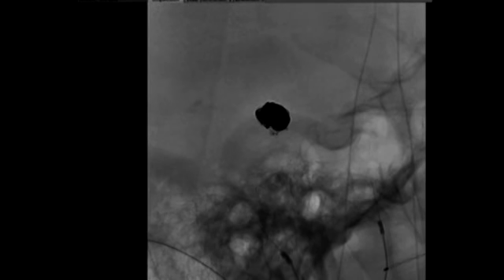In order to do that, we replaced the catheter that was used before, the balloon catheter, over an exchange wire. We used an Accelerator wire inside the balloon, and then we were able to remove the balloon catheter, and over that exchange wire, we used a stent delivery catheter. We used a Neuroform and delivery system in order to have the same platform, the same trajectory for the stent that we had for the balloon.